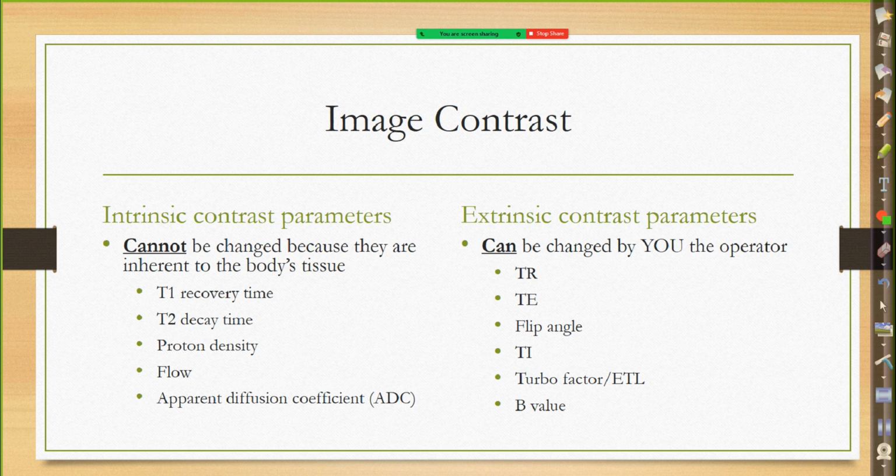So MRI is honestly not that great at imaging the lungs, so other modalities are usually better for detecting any pathologies within the lung, and things like pulmonary embolism. MRI is not usually the first modality of choice there. It's usually CT. And the reason is because lung is just air, and there's really no hydrogen spins within air.